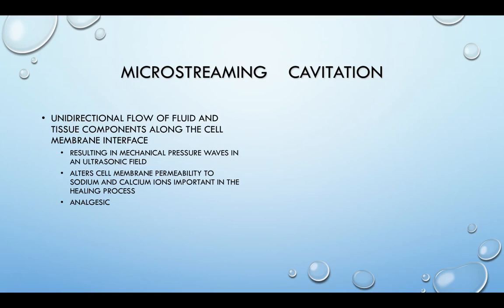So this unidirectional flow of fluids and tissue components, soft tissue, across the cell membranes creates these mechanical pressure waves within the treatment area. That alters the cell membrane permeability to both sodium and calcium ions, and those are really important in the healing process. So you end up changing how those cells are functioning during the healing process and facilitating the healing.